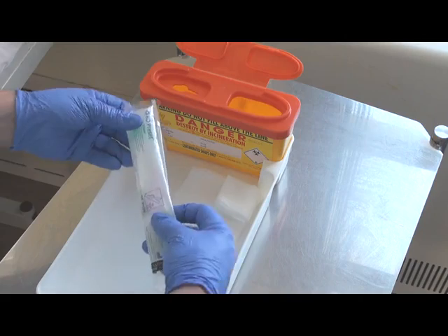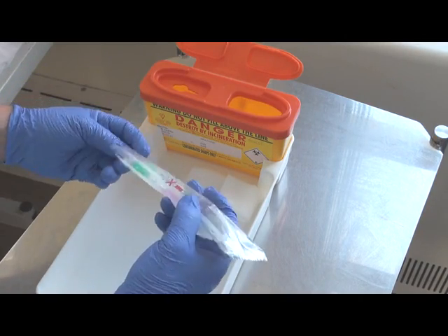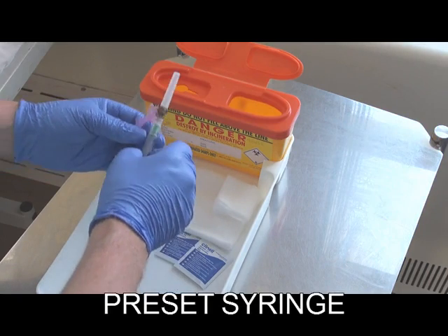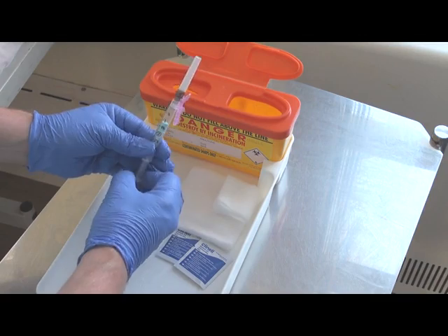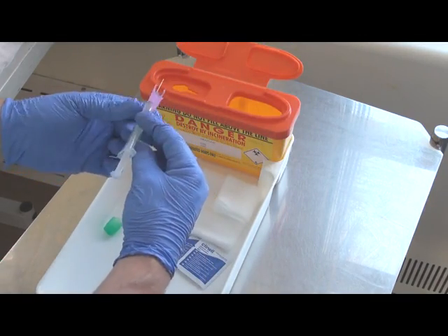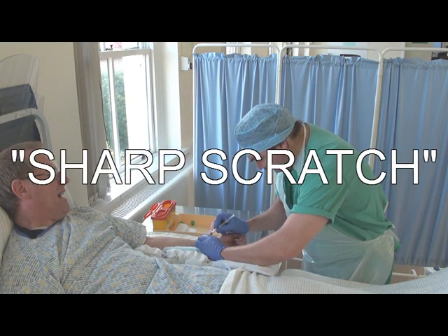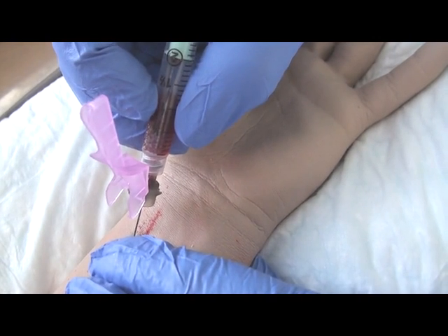Select a BD preset blood gas syringe. Remove the syringe from its package and fully depress the plunger to ensure optimum placement of the anticoagulant. Then set the plunger slightly above the recommended sample volume, which in this case is 1.6 millilitres. Remove the guard and position the needle carefully. Palpate the artery and advance slowly at about 45 degrees. Blood should automatically enter the syringe.